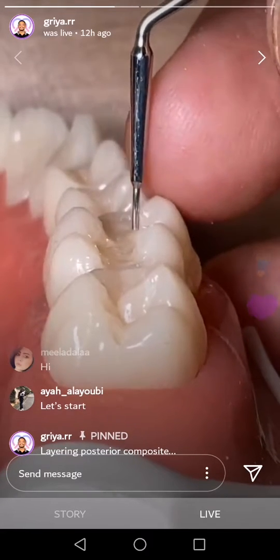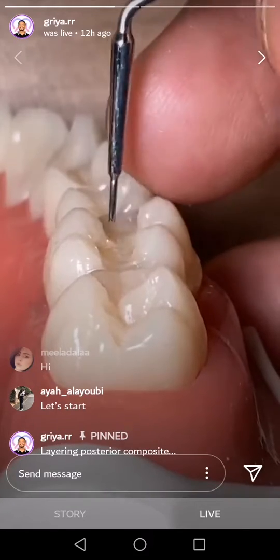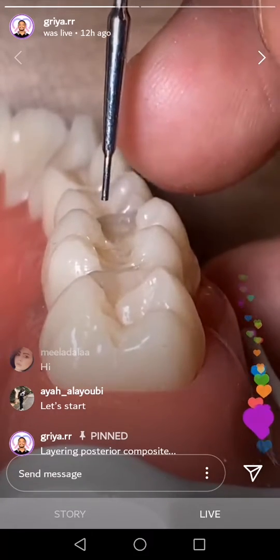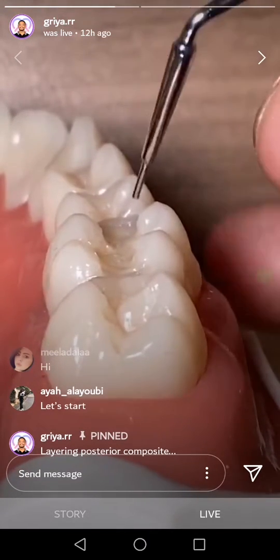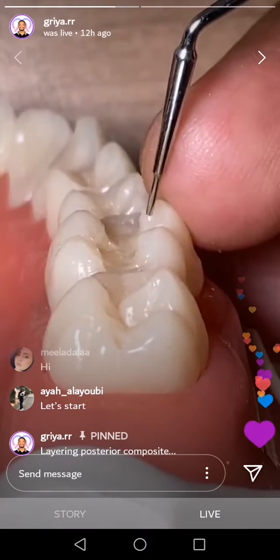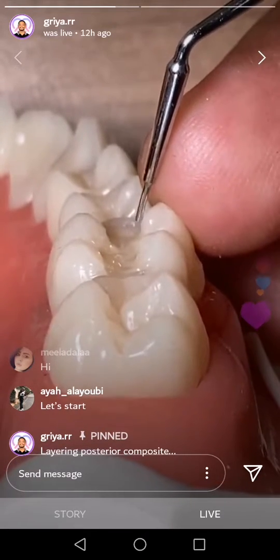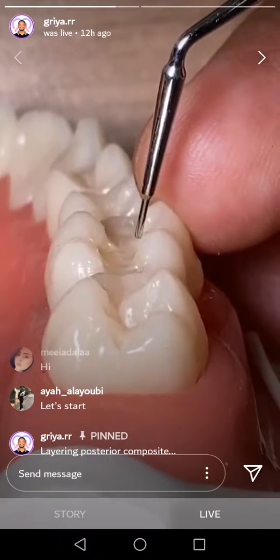Okay, so you need to measure from this side. How can you measure from this side? Yeah, you can use a mirror. You can use magnification. You can use dental photography. So you need to measure 2 millimeters from the top of occlusal into the bottom.